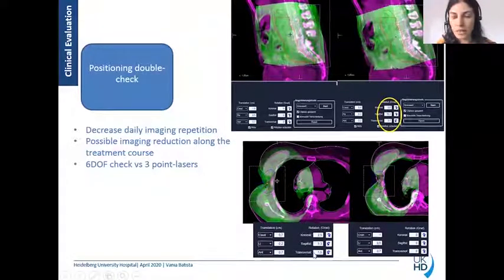We had several rotations to perform, and even with that, it was almost impossible to match the two images. But if you position the patient from the beginning with Align RT, and then you do a cone-beam CT, it's quite easier. Then your cone-beam CT only needs to give some small adjustment to match the tumor location, and you can directly start the treatment after this small adjustment.